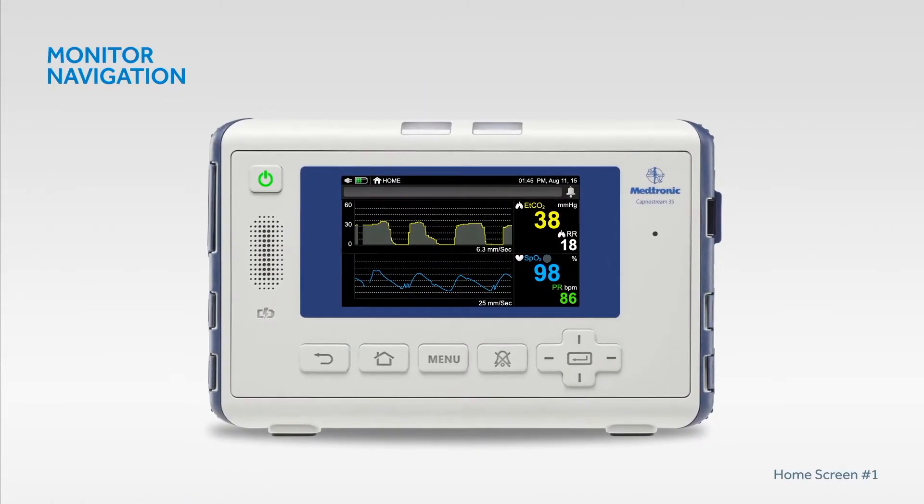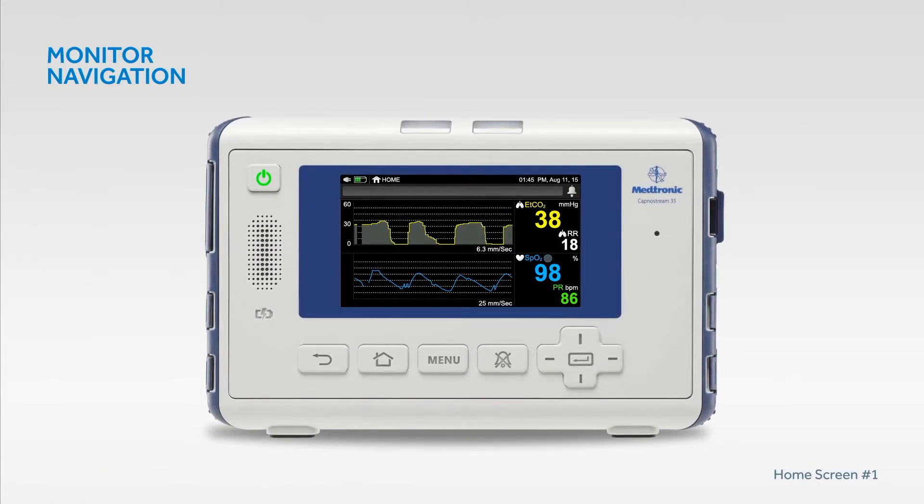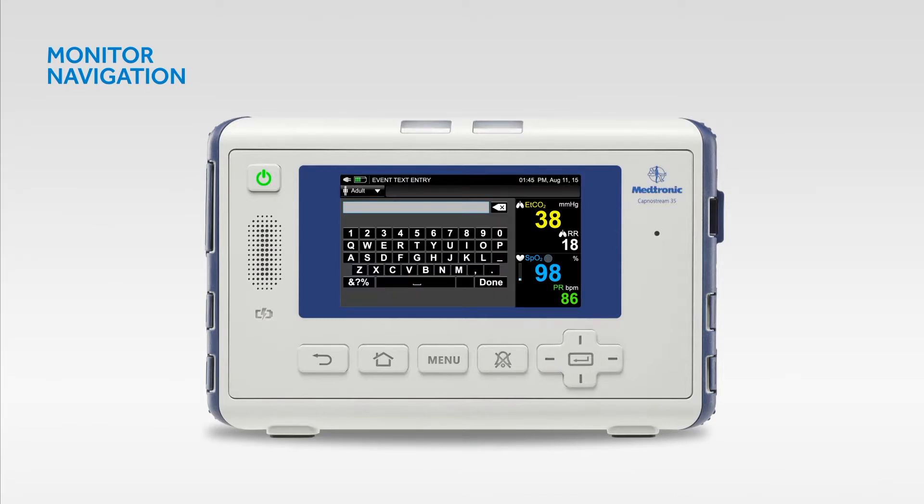To navigate the monitor's display screen, use the arrows to move up, down and across the screen and press the enter button to make your selection. Use the arrows and enter button to input letters and numbers when prompted by the cursor.